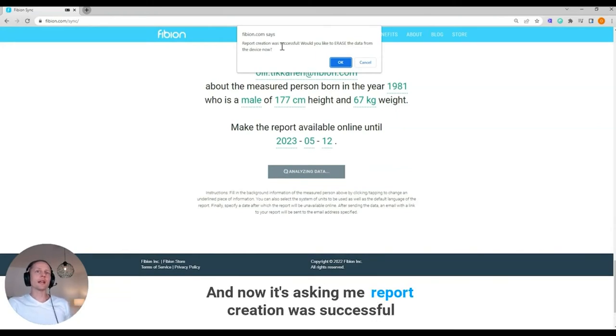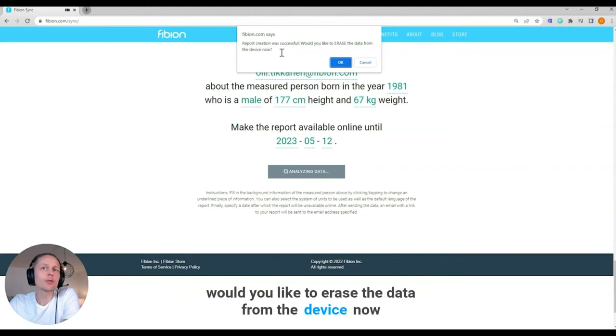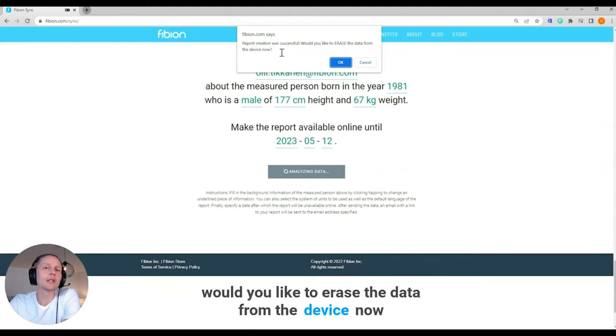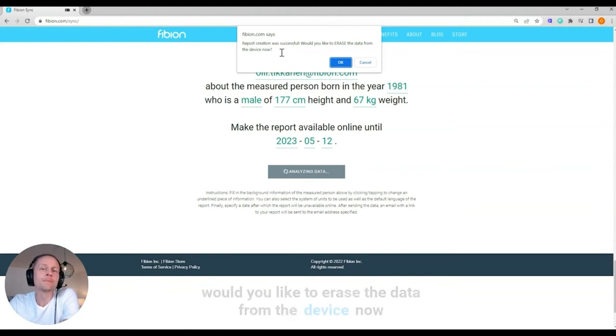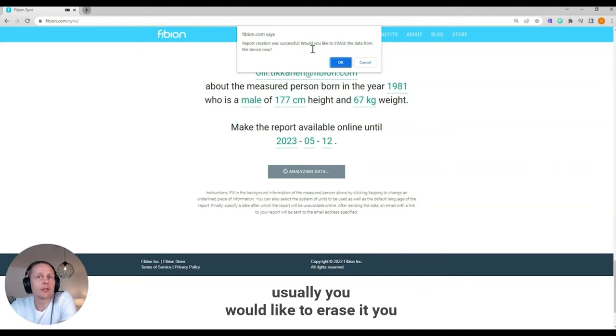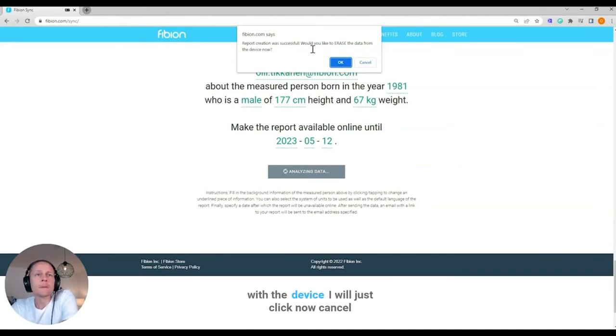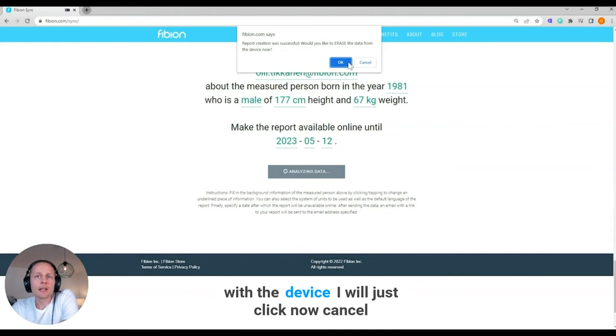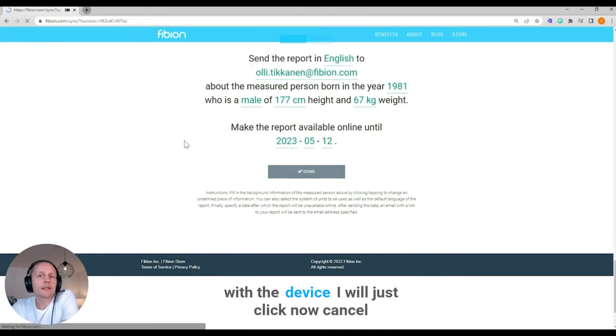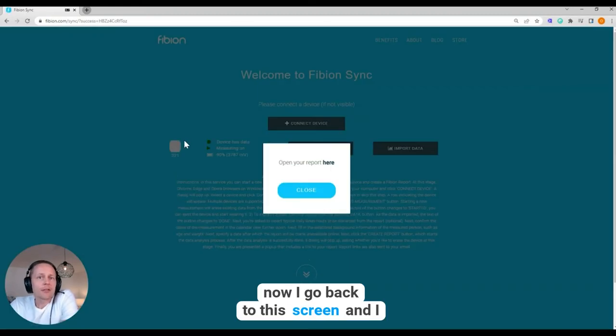And now it's asking me report creation was successful. Would you like to erase the data from the device now? Usually you would like to erase it. You probably are starting a new measurement with the device. I will just click cancel. Now I go back to this screen and I can open the report here.